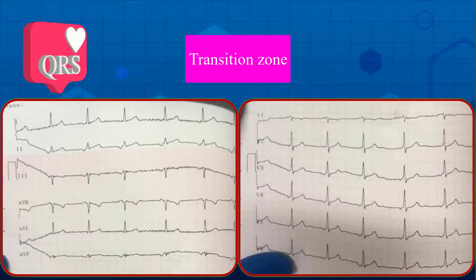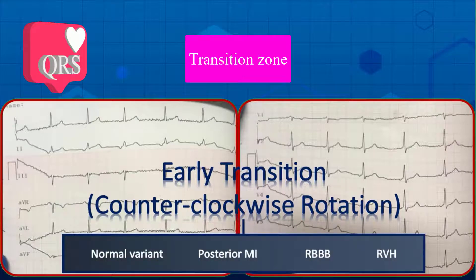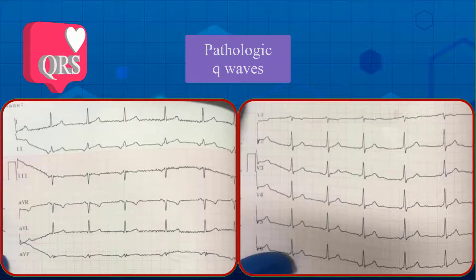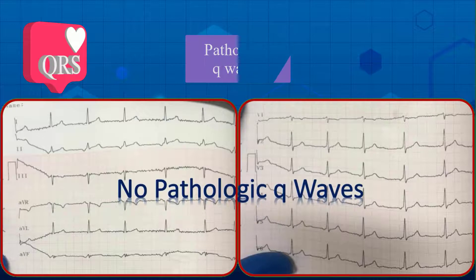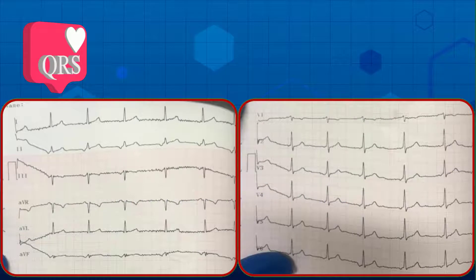Third: R wave progression and transition zone. The transition zone is in V2, so we have early transition — called counterclockwise rotation. It may be seen as a normal variant, posterior MI, RBBB, or RVH. In this tracing, early transition is due to normal variation. Fourth: looking for pathologic Q waves. There is no obvious Q wave in any lead, therefore there is no pathologic Q wave in this strip. In summary, the QRS complexes are generally normal.